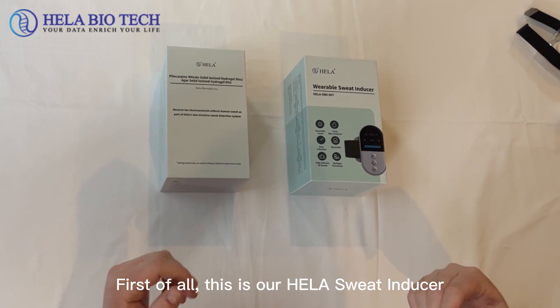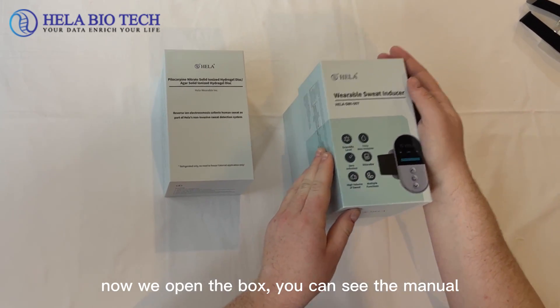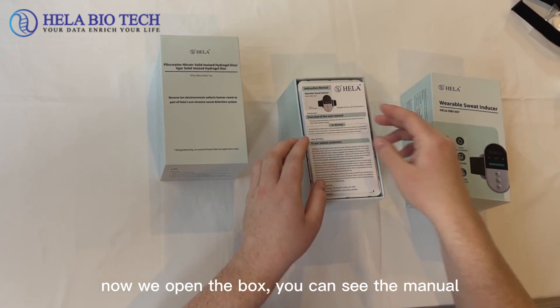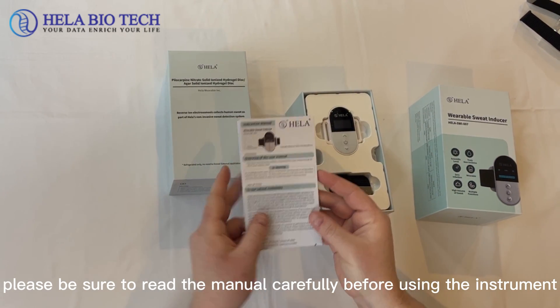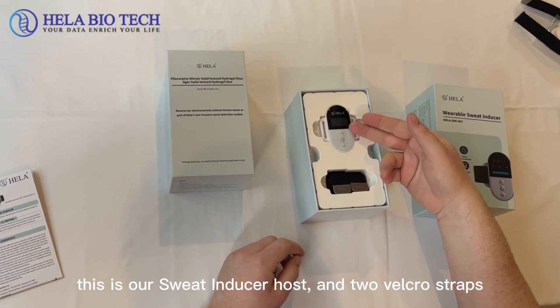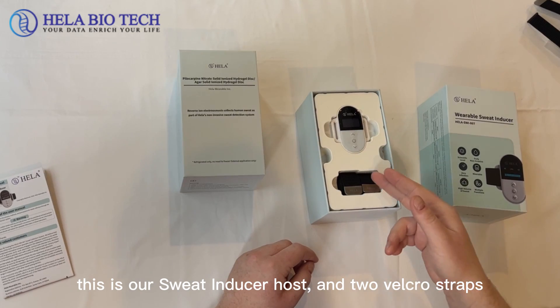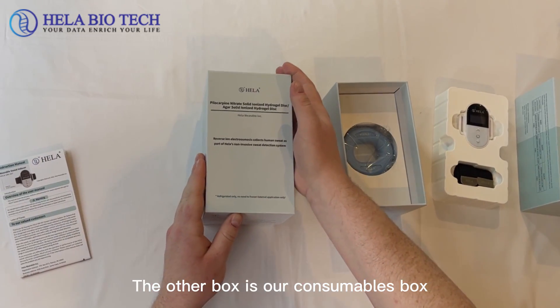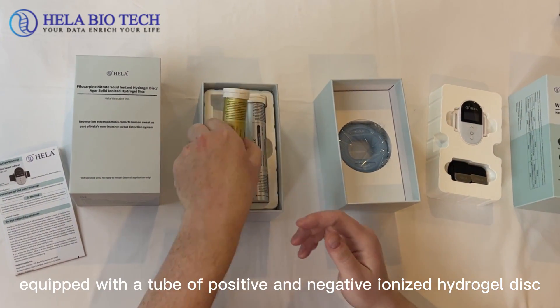First of all, this is the HELA Sweat Inducer. As we open the box, we can see the manual detailing how to use this instrument. Please be sure to read the manual carefully before using the instrument. This is our Sweat Inducer host and two Velcro straps. The other box is our consumables box.